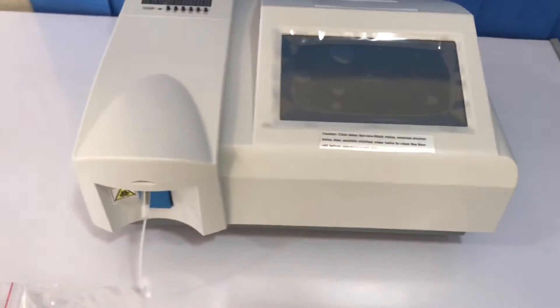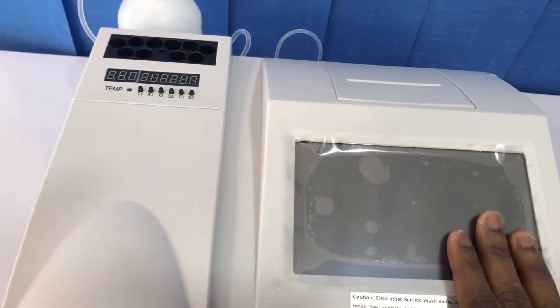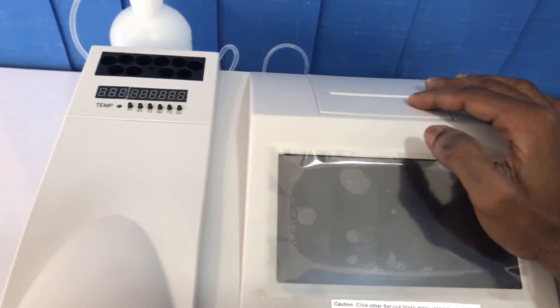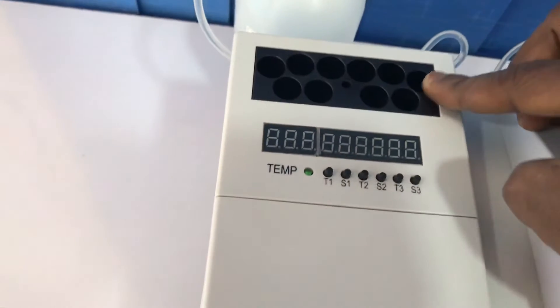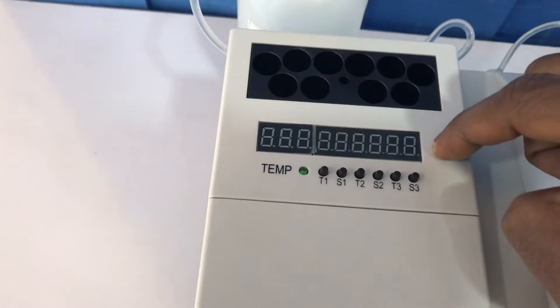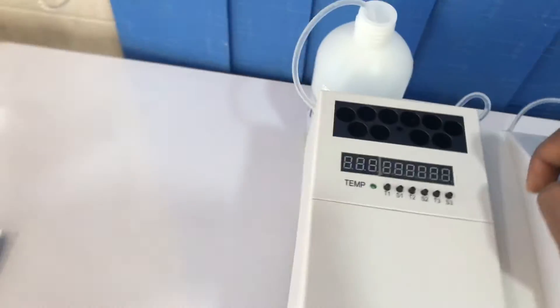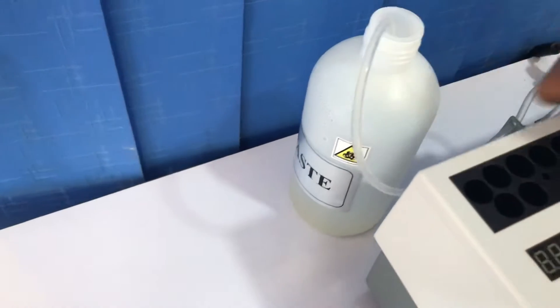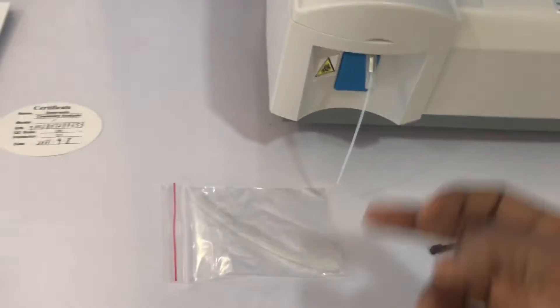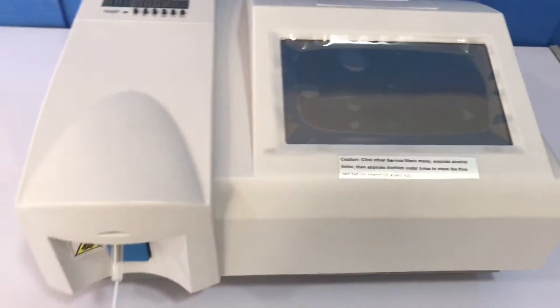This is the analyzer. The LCD screen displays your results and any other information. This slot is where you put your paper. This area is for incubation at 37 degrees Celsius. These are timers with an alarm system — when a set time is up, the alarm will notify you. There's also a waste bottle and a tube that moves waste from inside the analyzer into the bottle.